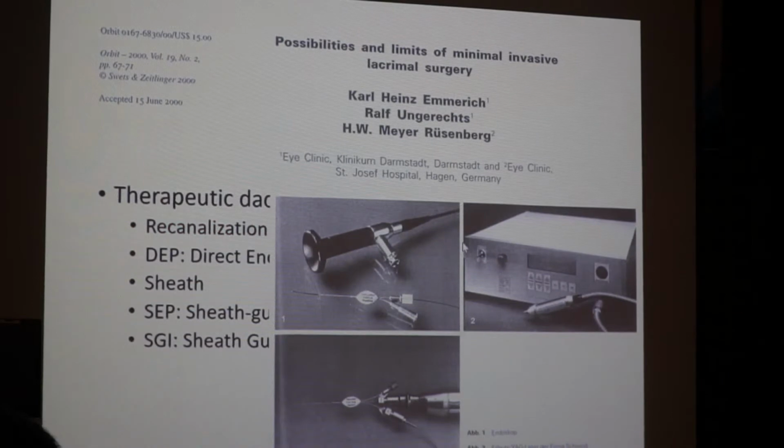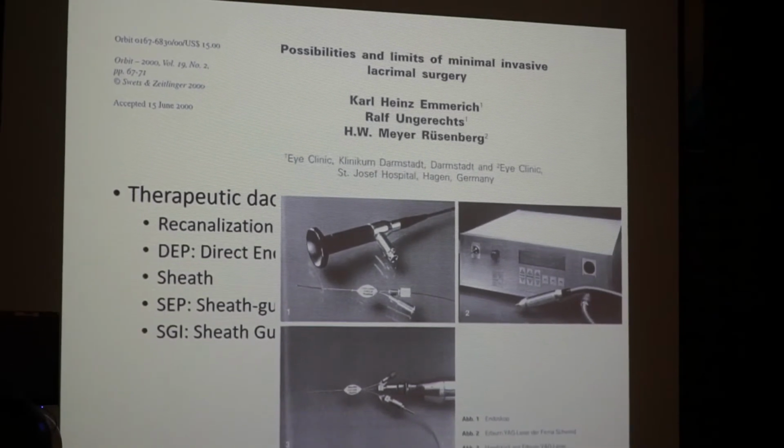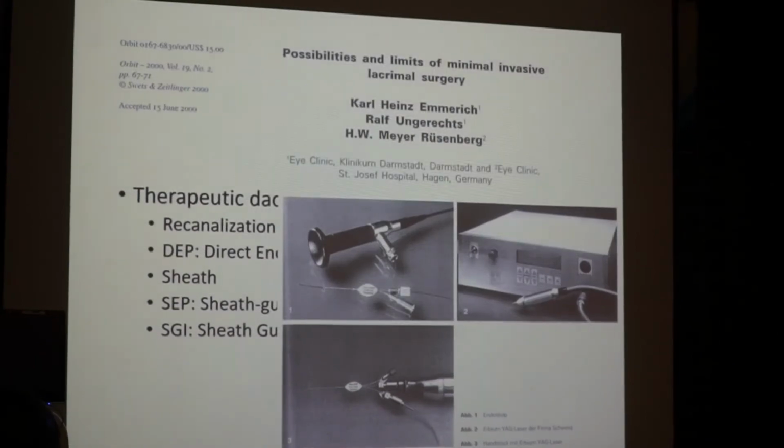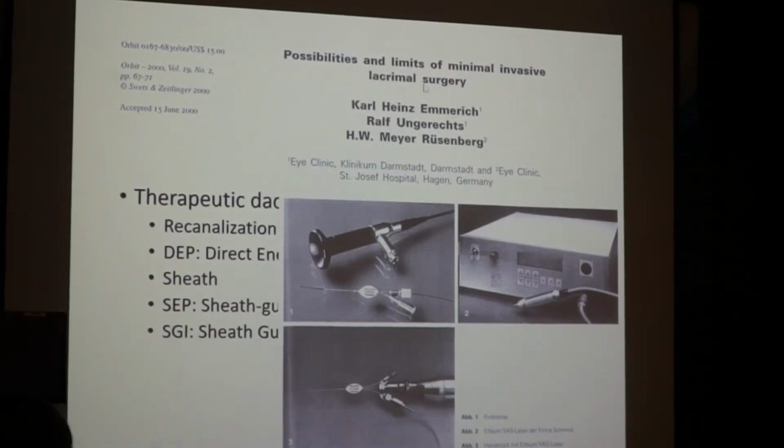Originally, the recanalization concept was developed by Dr. Emmerich in 2000. He was using special devices such as a laser probe or micro drill, and he defined his procedure as minimally invasive lacrimal surgery.